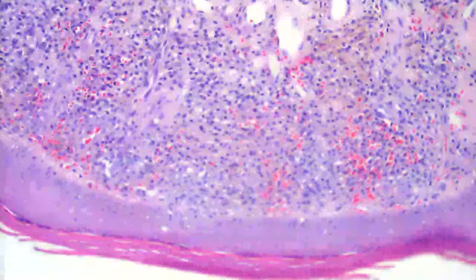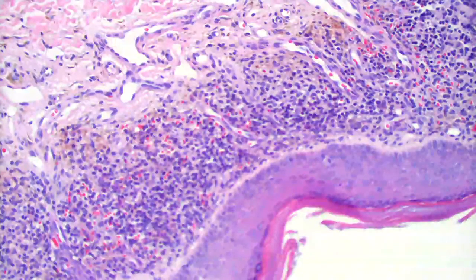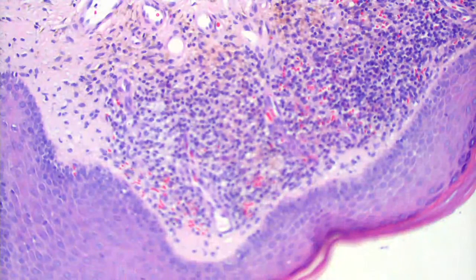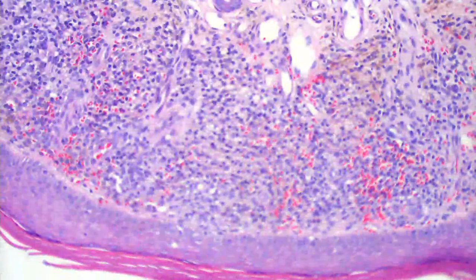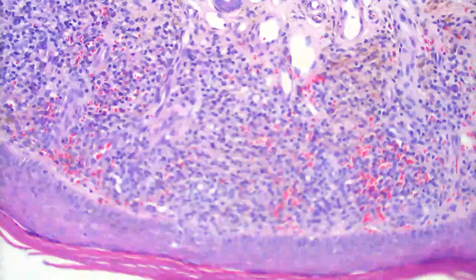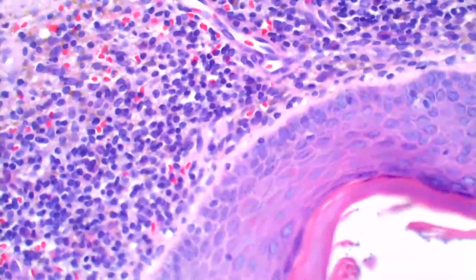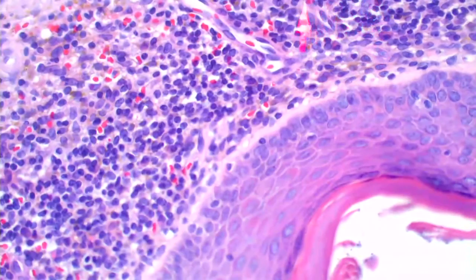Anything else from a lichenoid differential that you'd have to think about here? Well, from the lichenoid infiltrate perspective, right now I cannot think of any. So you're so confident it has to be lichen aureus, you wouldn't even think of lichen planus? Or it could be like syphilis or anything like that, okay. I mean, but it doesn't have all the features in the epidermis for lichen planus. Good. Yeah, it doesn't have the irregular epidermal hyperplasia and wedge-shaped hypergranulosis, and those things, so probably not lichen planus. And you can get a lichenoid form of syphilis, you know, and there are a couple of plasma cells here and there, so he's got 4 right there together, 5, so. He gets an RPR then.